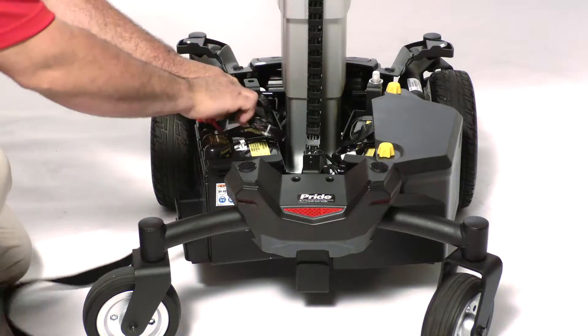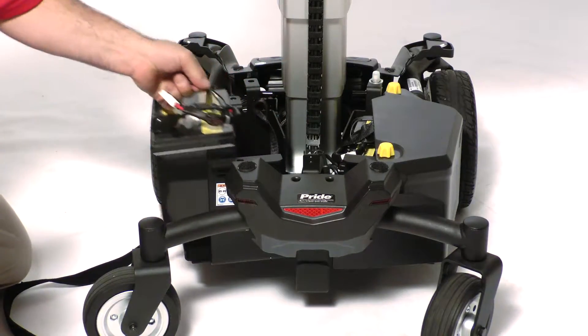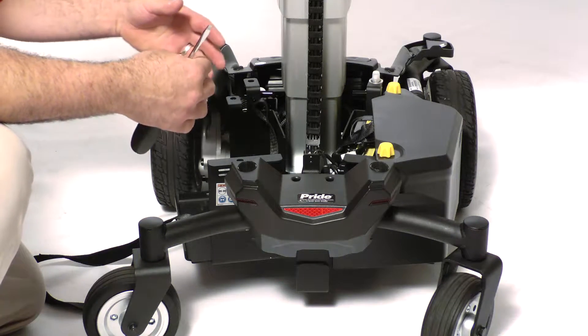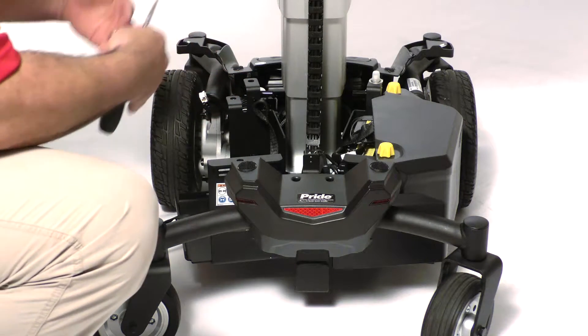Disconnect it and take it out of the chair. Everything you will need will be on the left side of the chair.